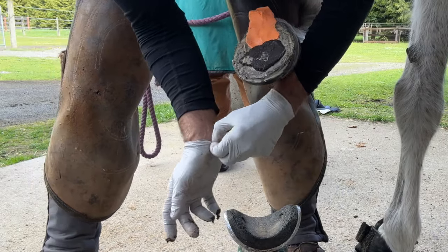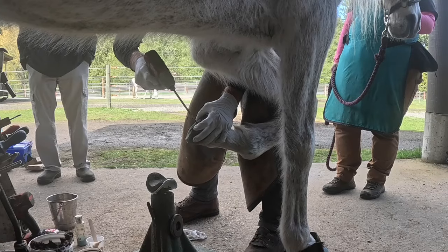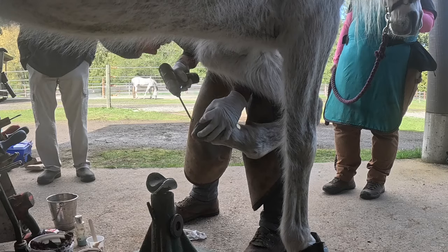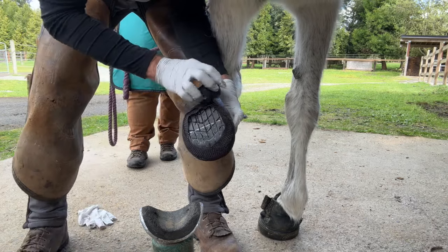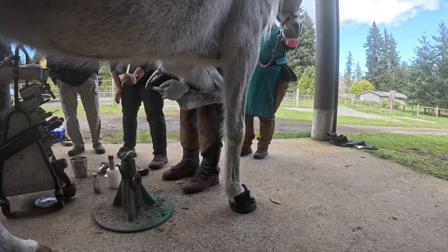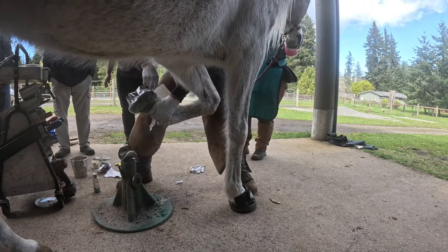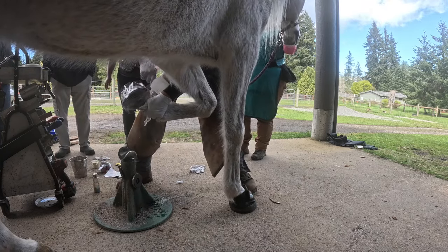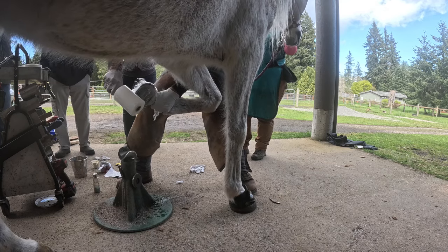Doubling up on your disposable gloves is a handy trick when you need to change one out. Using set screws once again. Work quickly with your casting material. It does set up quite quick once you've got it wet. Using a little bit of glue to anchor in the last part of the cast. And lastly, when you're using stretch wrap, make sure you go up over the heel bulbs and around the toes so you don't pull the casting material off the heels.